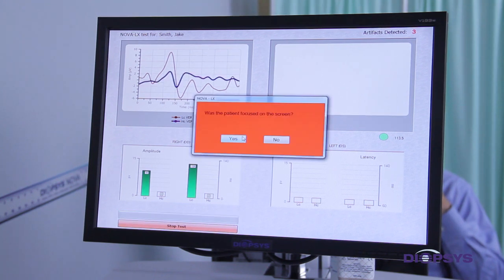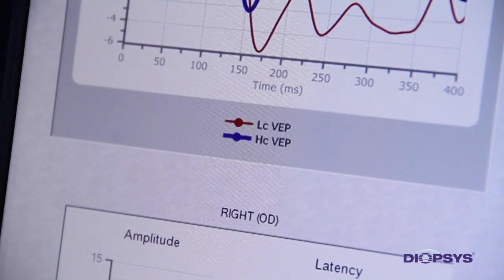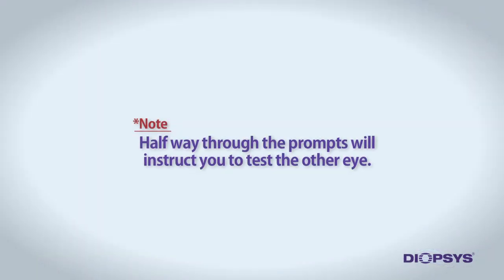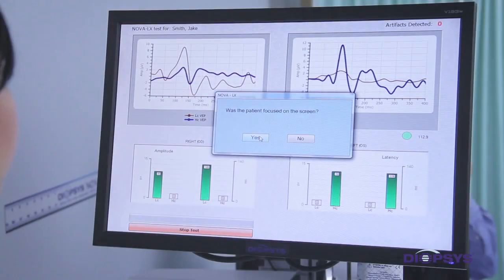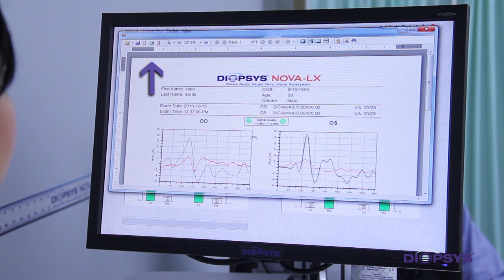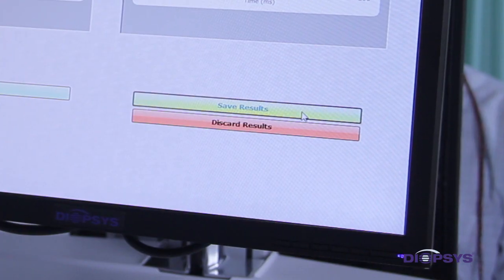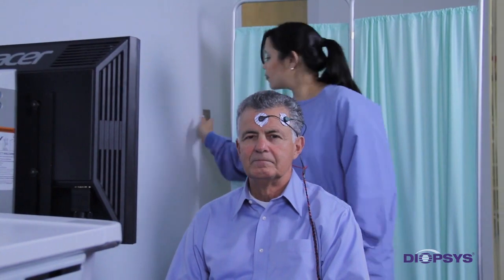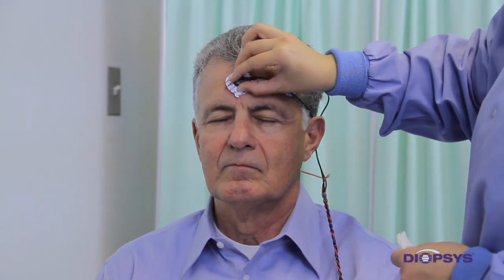Continue to follow the prompts on the screen after each section of the test is completed. Halfway through, the prompts will instruct you to test the other eye. Once all sections are successfully completed, you may choose to print the final report. To exit the report screen, simply click the X located within the upper right-hand corner of the window. Click on Save Results. You may now turn the lights on and gently remove the electrodes from the patient. You may need to use gauze and alcohol to remove any remaining conductive paste from the electrode locations.